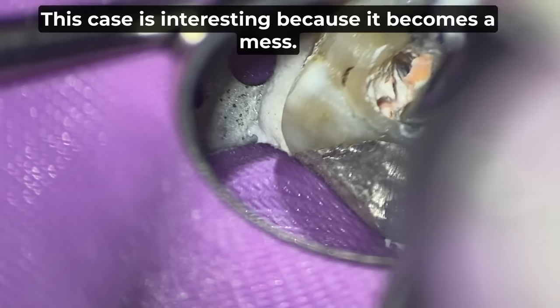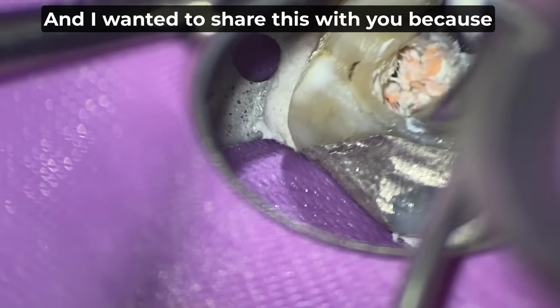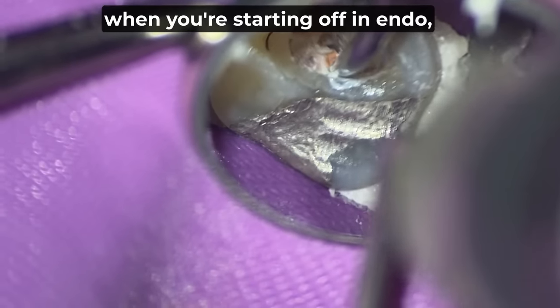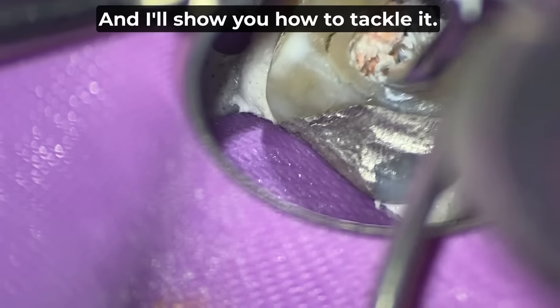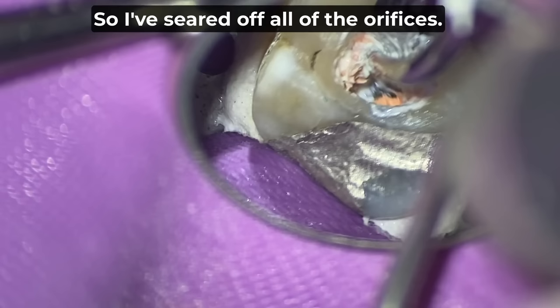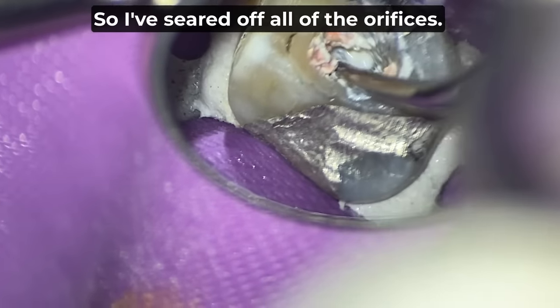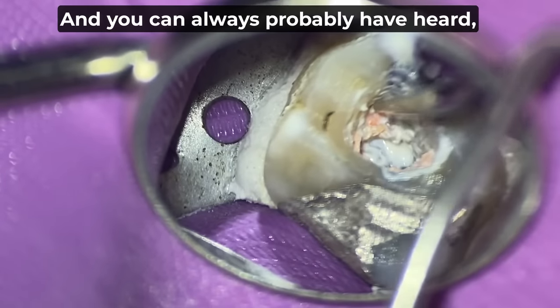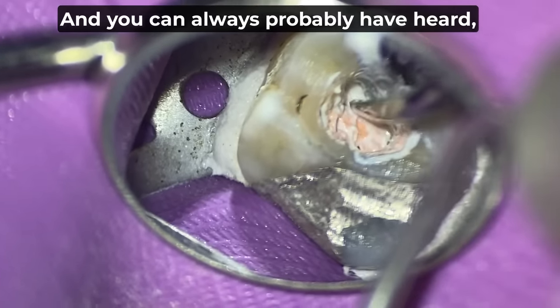This case is interesting because it becomes a mess, and I wanted to share this with you because when you're starting off in endo, these things become a mess, and I'll show you how I tackle it. So I've seared off all of the orifices. Now, does this normally happen? No. Does it happen once in a while? Heck yeah.